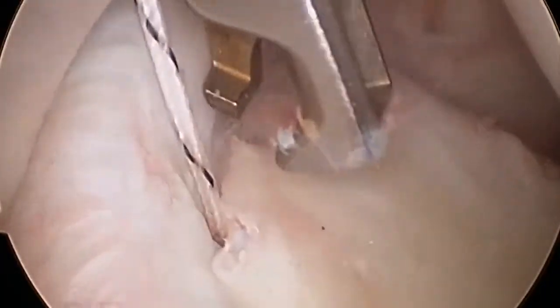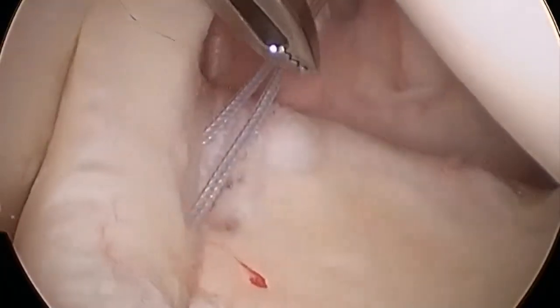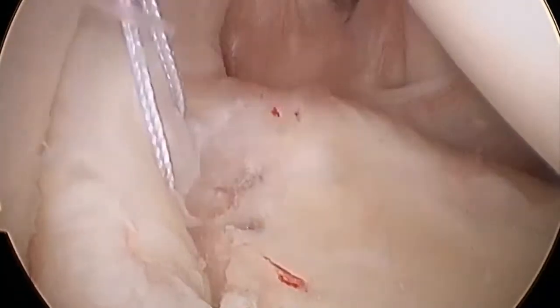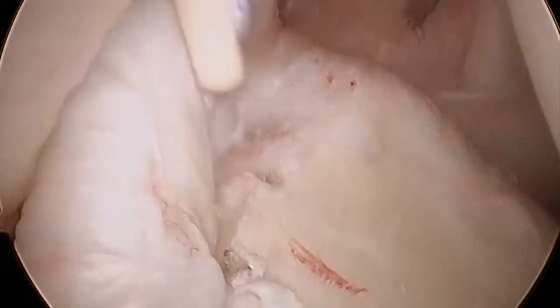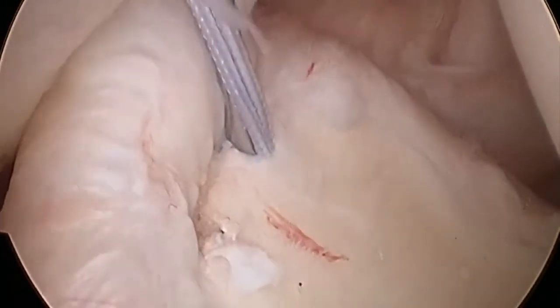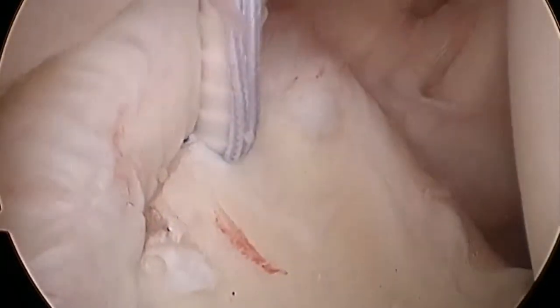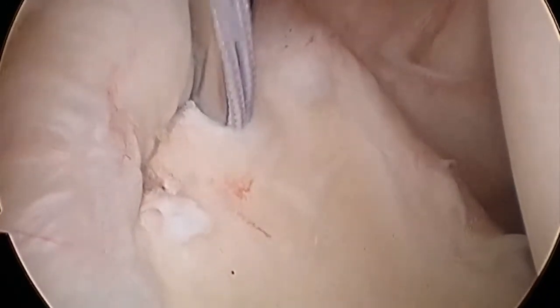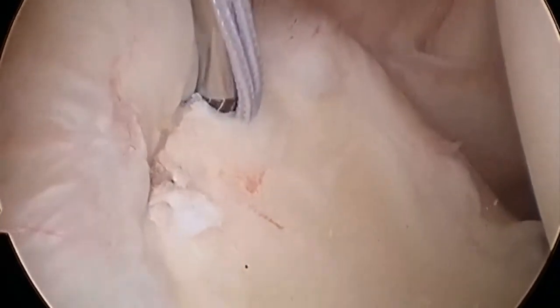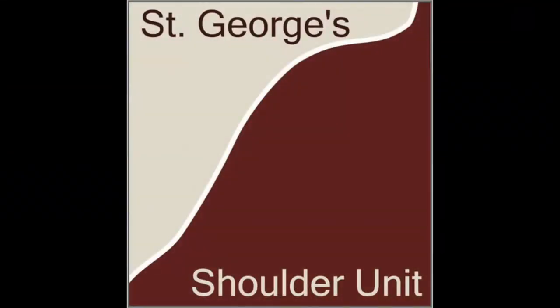The suture tails are cut flush and the process can then be repeated with the anterior sutures. At the end of the procedure, the labrum has been repaired and there is almost no suture material inside the joint.